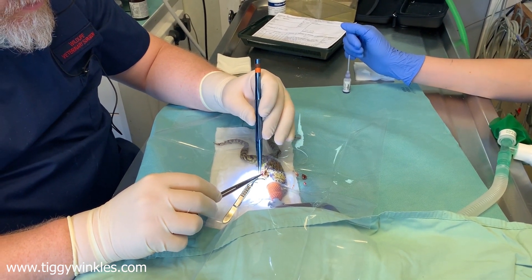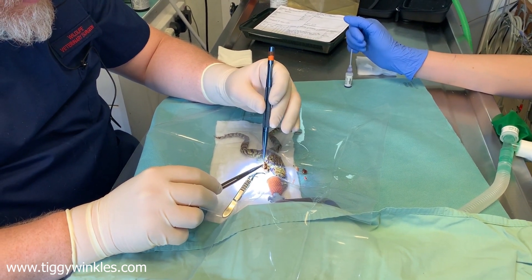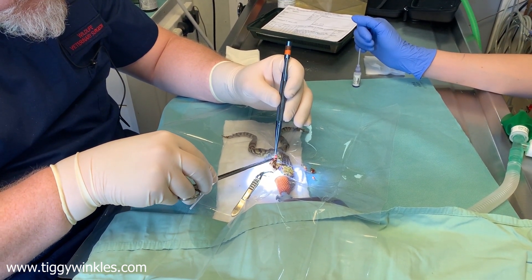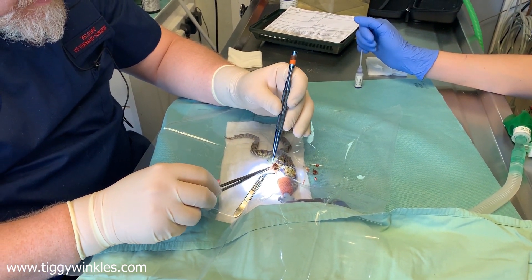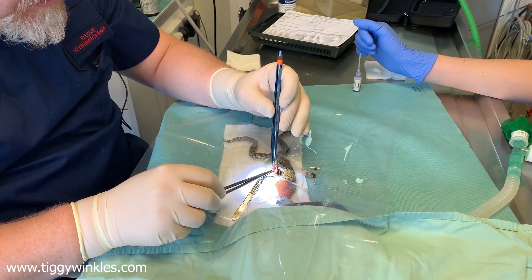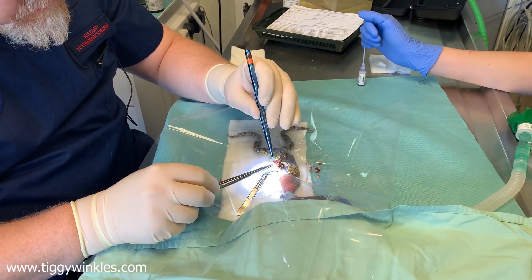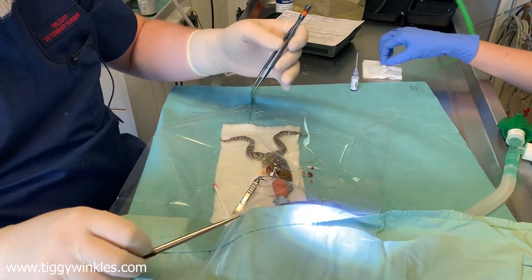Now we just need to see how much we have to cover. We still have quite a lot of spare tissue here — quite a lot of spare muscle — so I think we can lose that little bit. There might be some blood vessels in here but we can always tie it off if it bleeds. There's a lot of space on the underside and still quite a lot of muscle. What we're going to do is bring this back over the top and try and close it all in there. We'll do that with some stitches now.